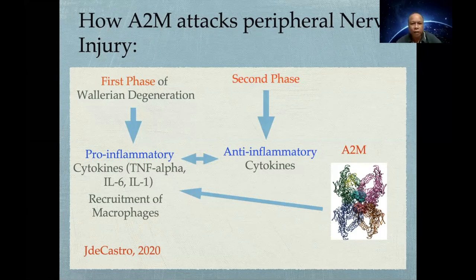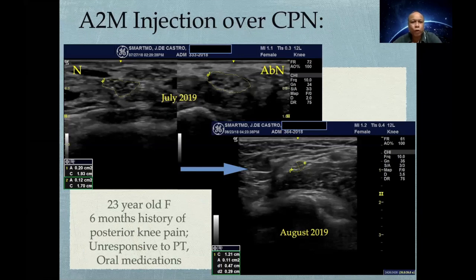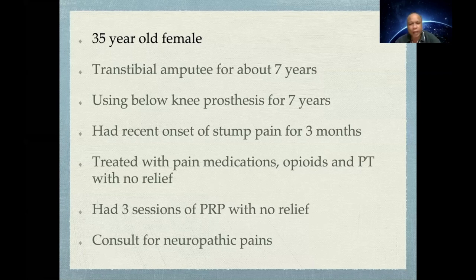So here is a patient of mine we injected in July 2019, and you can see here a very abnormal, very swollen nerve by cross-sectional area. And after a month, when we examined the patient again, the nerve had reduced to almost 0.11 in cross-sectional area. And this is a patient with posterior knee pain, unresponsive to physical therapy and other medications. Now, the patient is a 35-year-old female, transtibial amputee for about 7 years, using a below-knee prosthesis, had recent onset stump pain for 3 months, and we started with pain medications, opioids, physical therapy, no relief. She had 3 sessions of PRP, still with no relief.